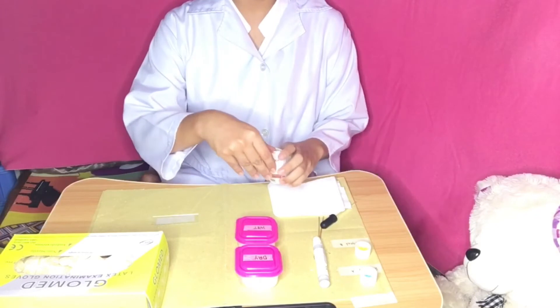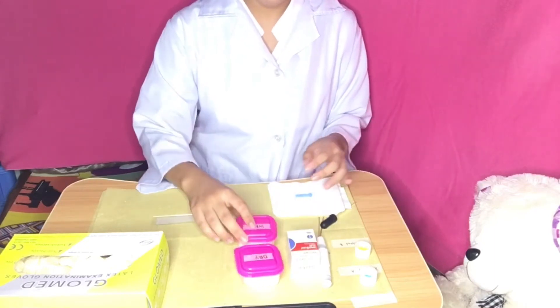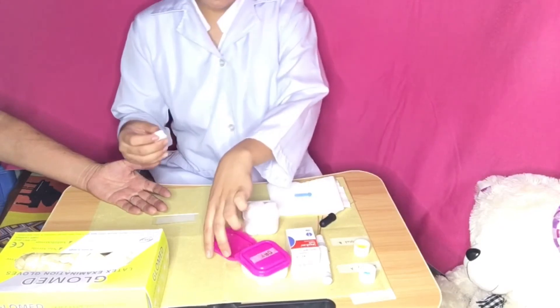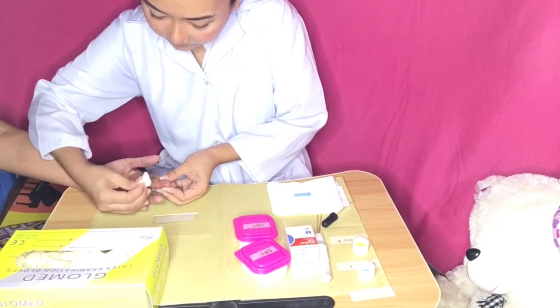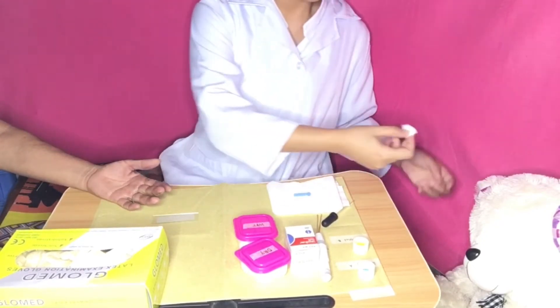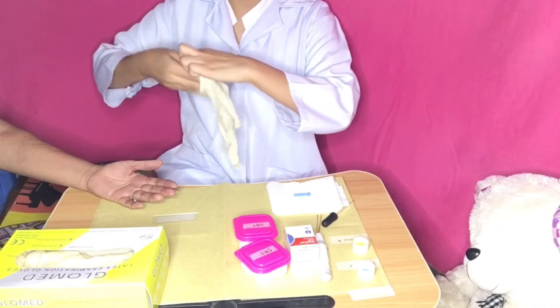Prepare the equipment. Obtain the lancet from the container and place it on a clean, dry paper towel. Choose a vascular puncture site. Clean the site with the antiseptic swab and allow it to dry completely.